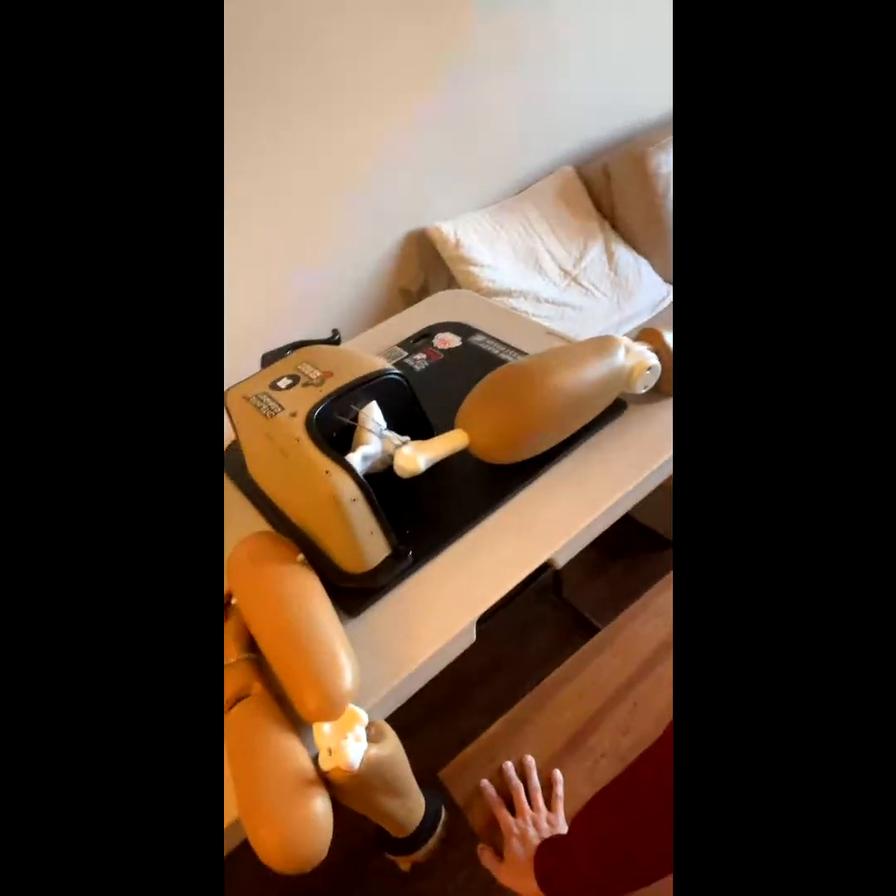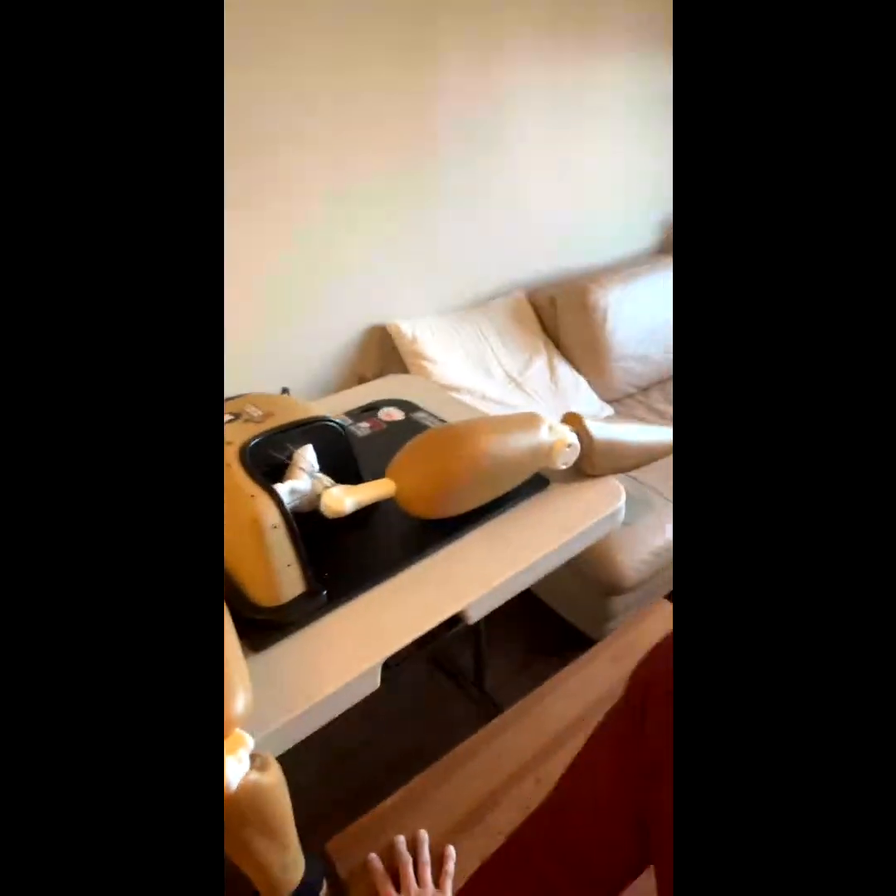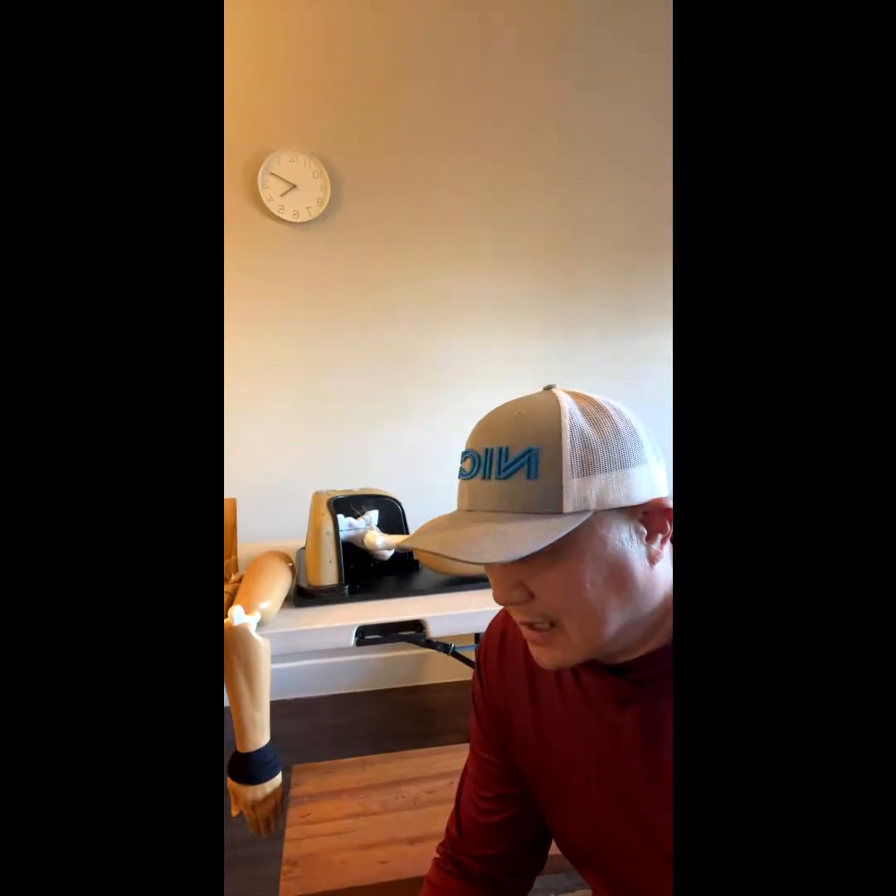The next one is the biggest clunk — it's a hip dislocation simulator, a hip dislocation model. I hope you don't get in a car accident, but if your knee hits the dashboard and your body goes forward, the hip is going to dislocate to the back.